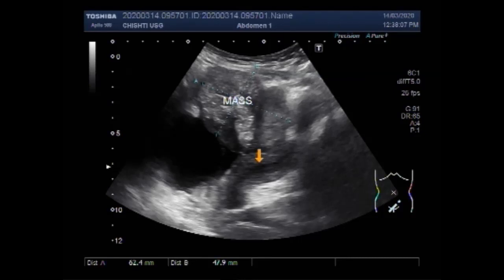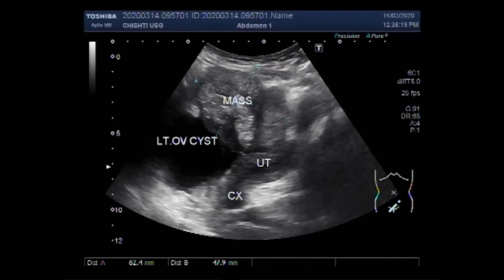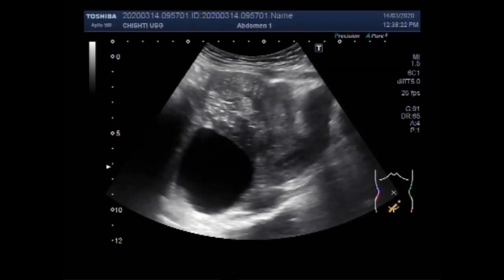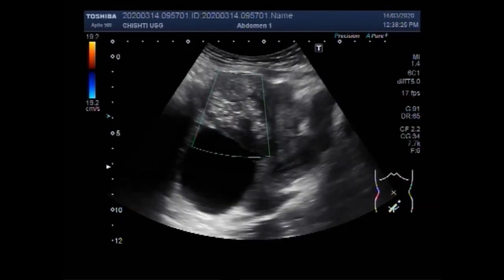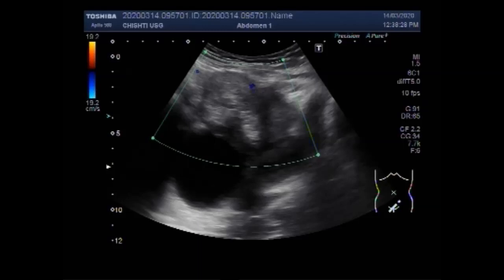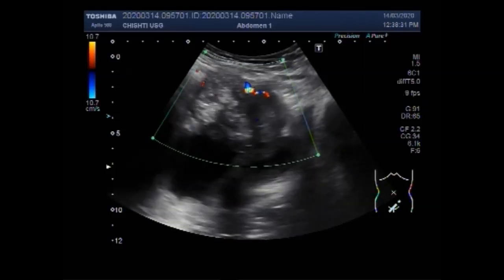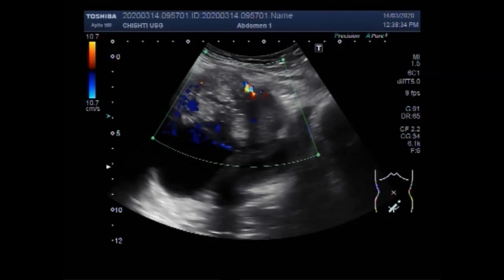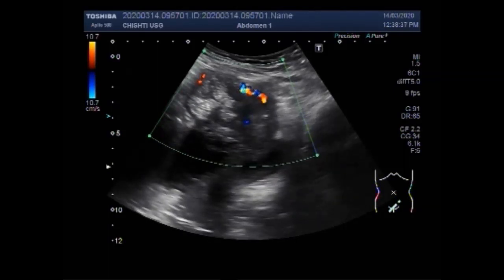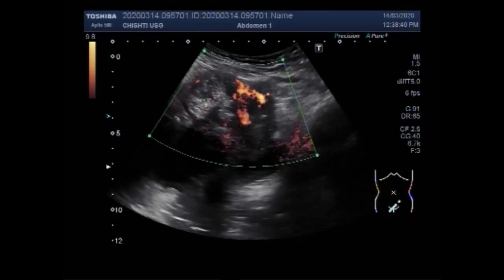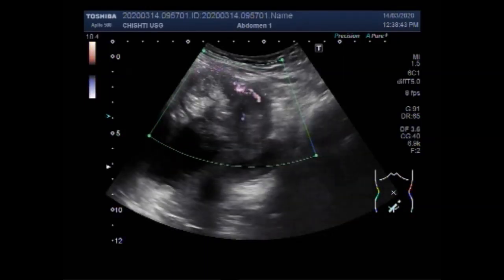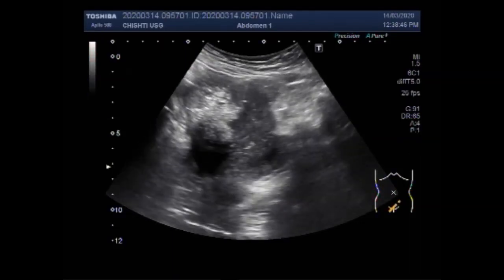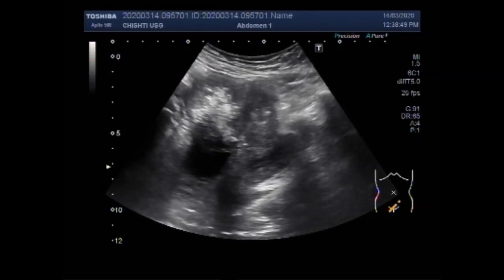This is the uterus and this is the cervix; this is the large left ovarian cyst. Metastatic ovarian cancer is an advanced-stage malignancy that has spread from the cells in the ovaries to distant areas of the body. This type of cancer is most likely to spread to the liver, the fluid around the lungs, the spleen, the intestine, the brain, skin, or lymph nodes outside of the abdomen.